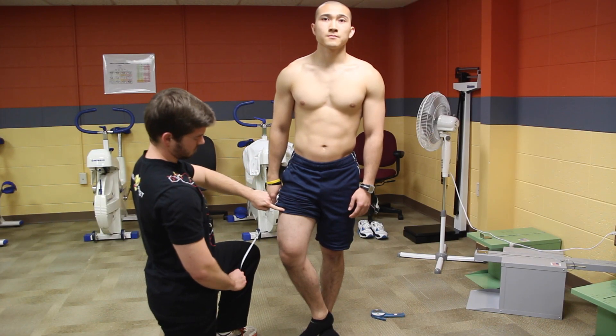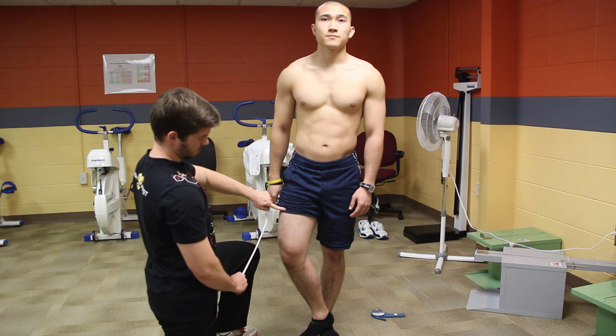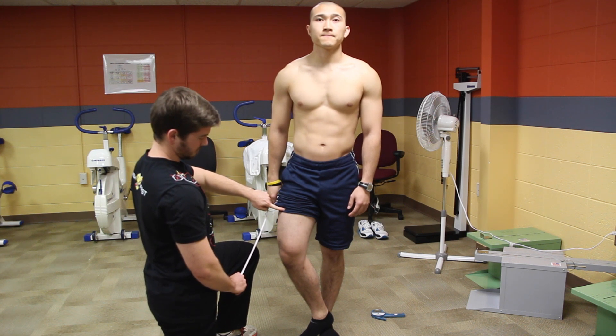Once you've completed all of your measurements, go through a second time in the same order, and then obtain a third measurement if necessary.